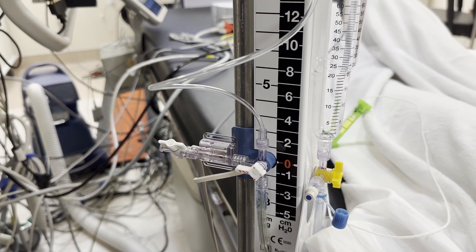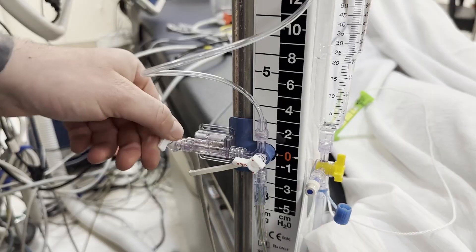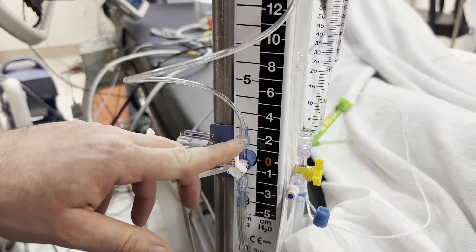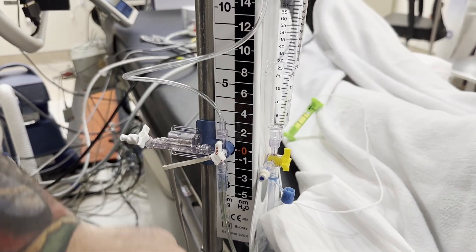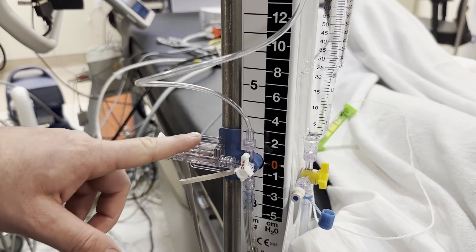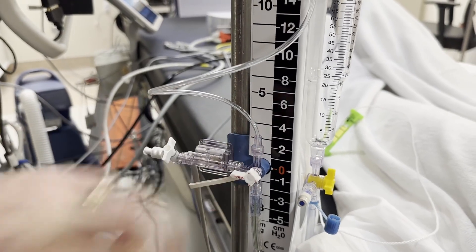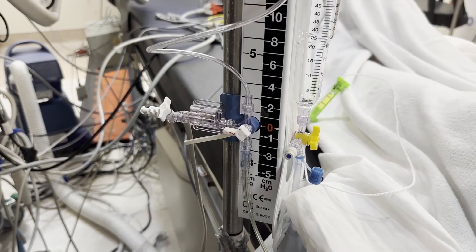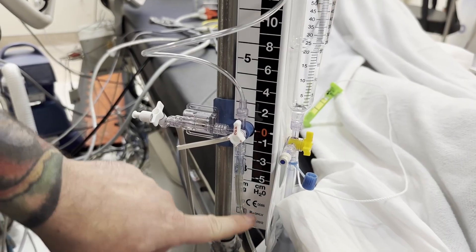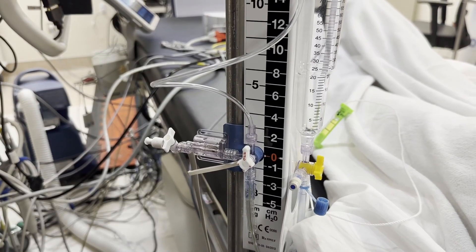Once they say it's been zeroed, we go ahead and close this, close this, and then turn this off to the drain. Now we're going to go from the patient to the transducer — and this is how we check ICP. Once we get a good ICP reading, we want to remember to turn it off to the patient so we can continue to drain. Every time we want to get an ICP reading, all we do is turn this transducer from the patient side to the transducer.